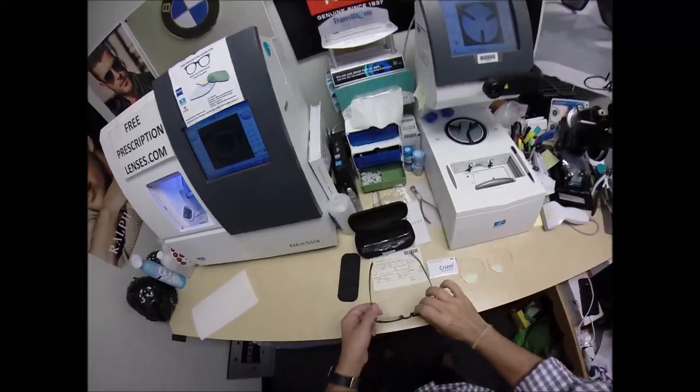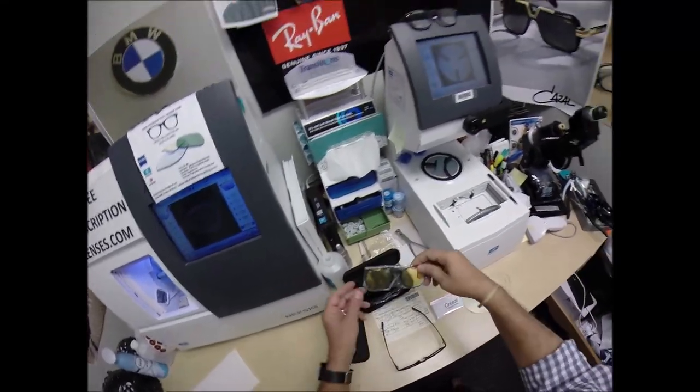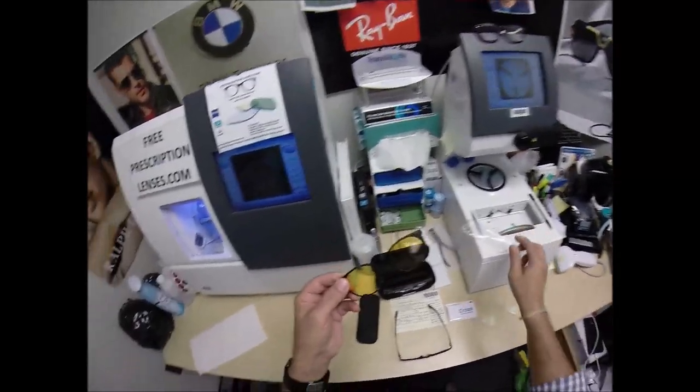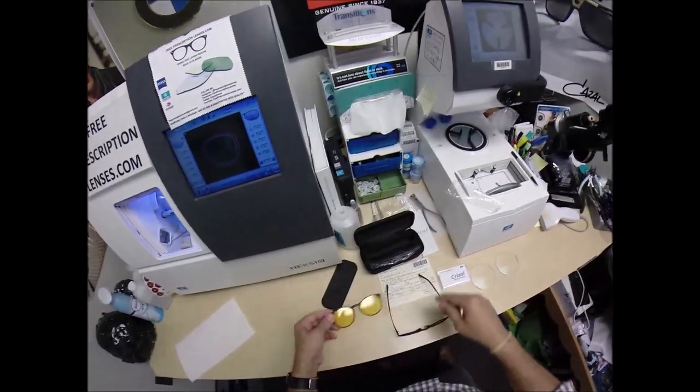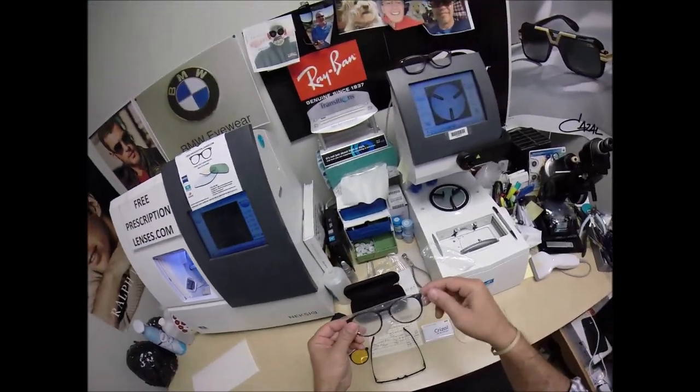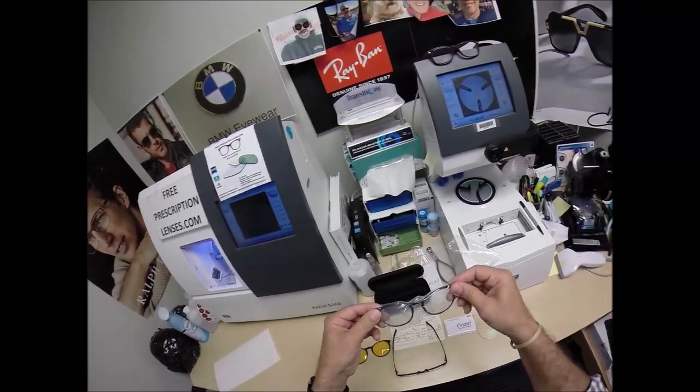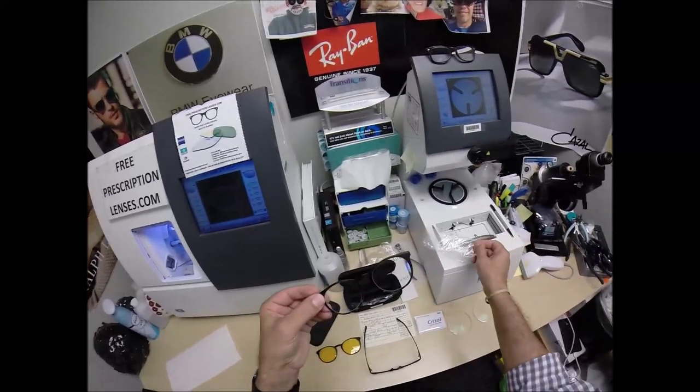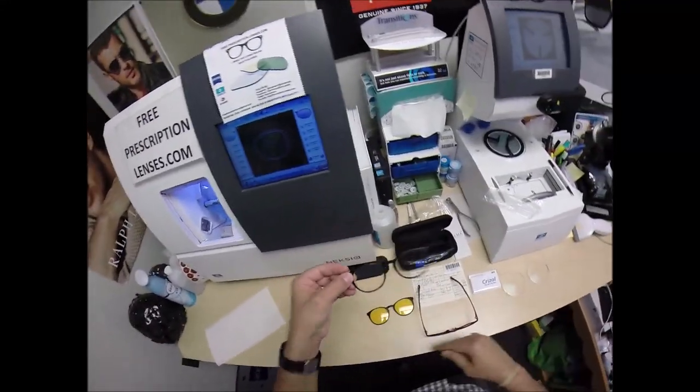But what I love about this frame, it comes with four clip-ons. Let me take everything out. There is a yellow nighttime fog. It's also known as a shooter's yellow. Skiers like it. It has an anti-glare clip with blue blocking ability for that can go over your lenses.